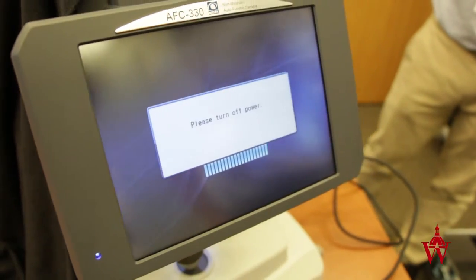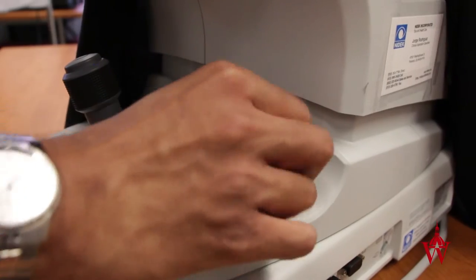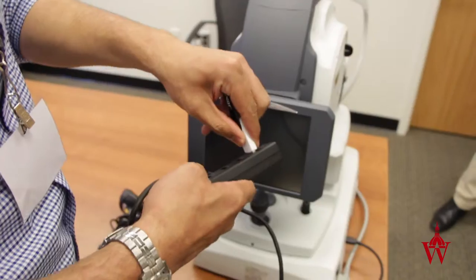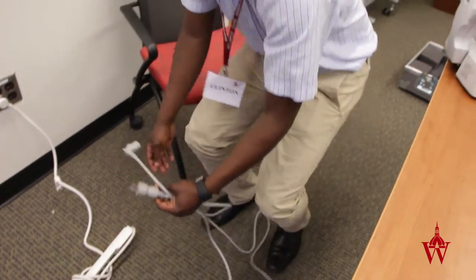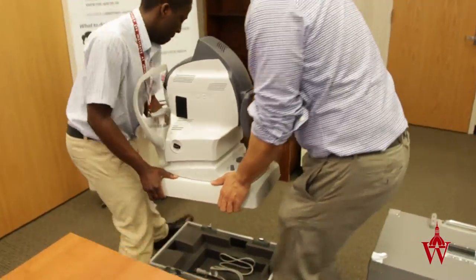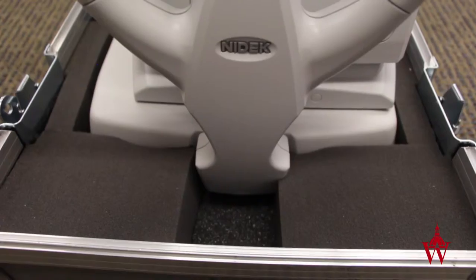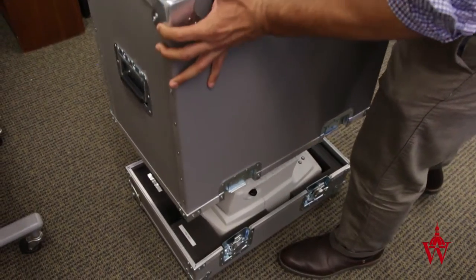Make sure you have saved all pictures on the USB drive with subject IDs before deleting the pictures on the machine at the end of the day. Take out the USB stick and replace the lens cap. Disconnect all of the cords and store them in the containers. Place the power cord at the bottom of the box. When storing the camera, the chin rest goes on the side labeled for it. Put the top on the case and make sure it is locked.